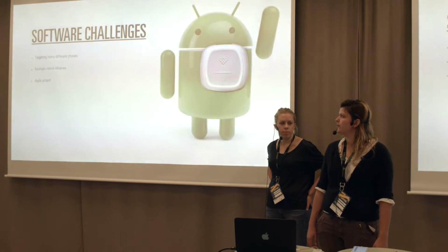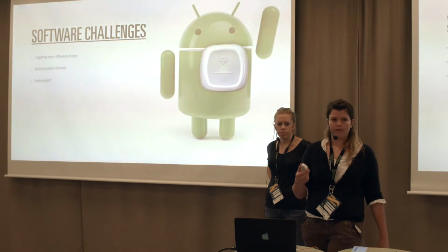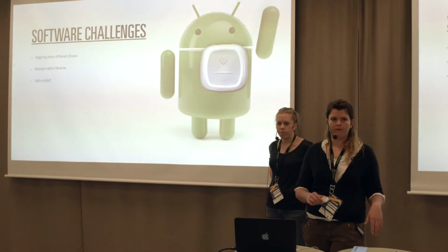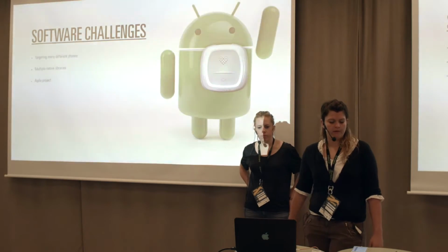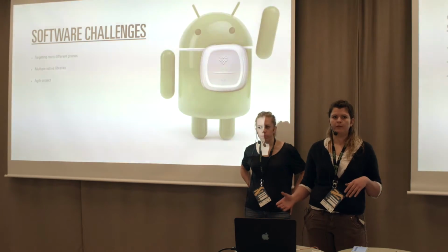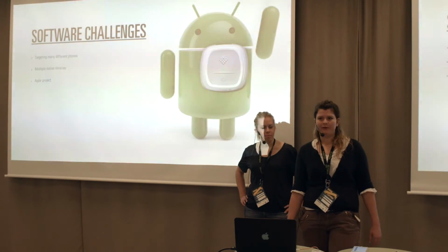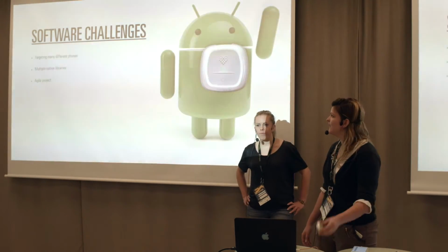But in this project, it was also an issue with Bluetooth, because this device doesn't have a big flash memory, so we have to send all the data instantly to the application. And not all phones have the Bluetooth configuration that is able to do that. So for some phones, if we see that we lose a lot of data, we need to disable, for example, audio and just take the electrocardiogram. We learned a lot, and for version 2, maybe we should have a bigger flash memory on the unit.